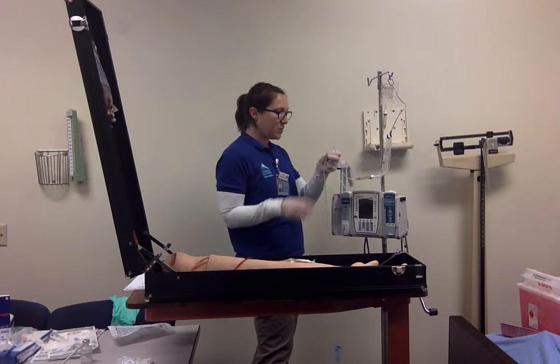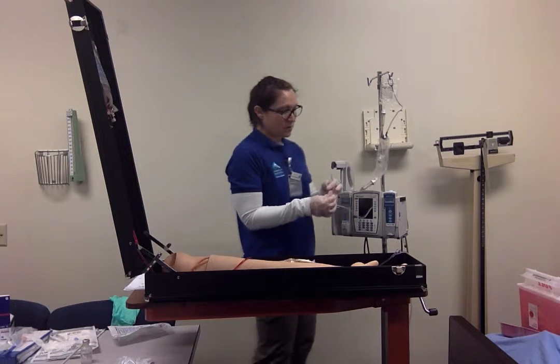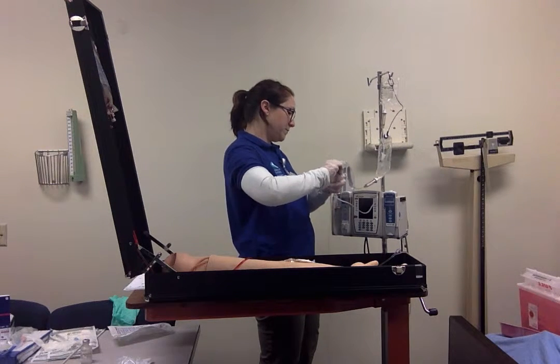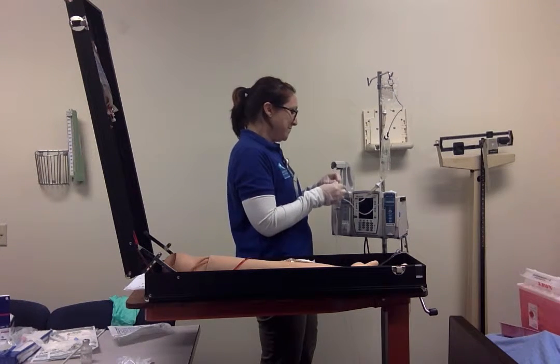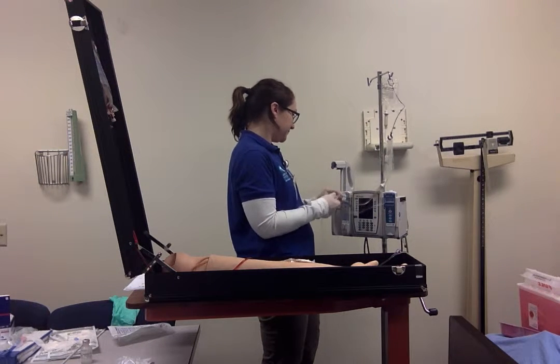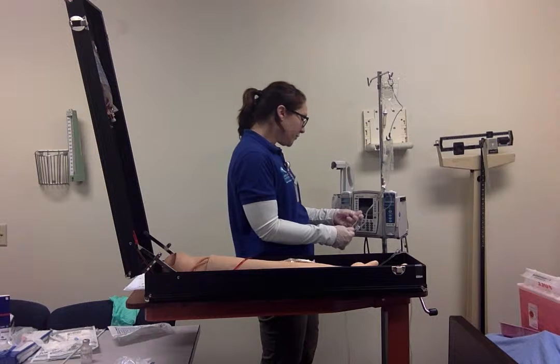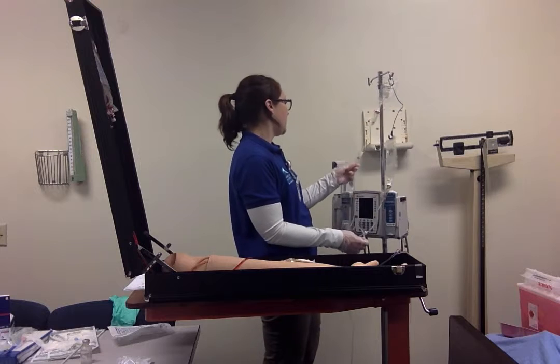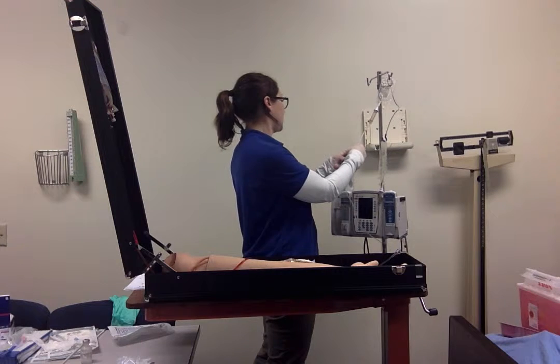Now, because the clamp is below the port that I'm going to be using, I don't need to clamp for the primary, but I do need to clean it using aseptic technique. I'm going to cleanse off the port again. Okay. And then making sure, we figured it out to be 17 drops per minute, so I'm going to put in the new drop factor for our piggyback. And then I'm going to go ahead and unclamp this and get that going.